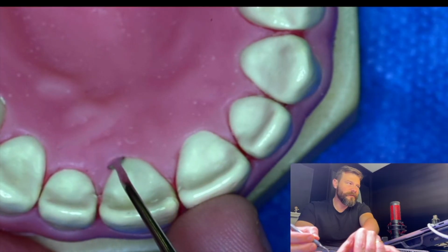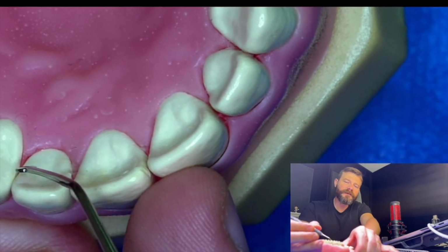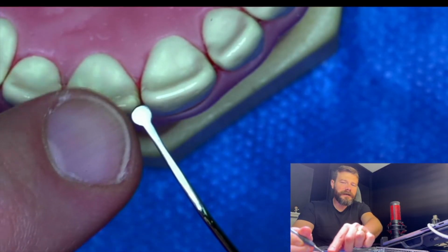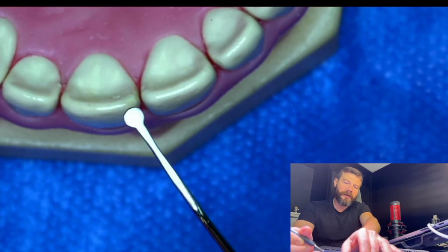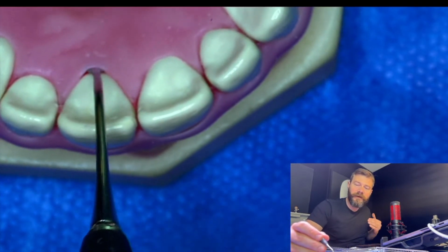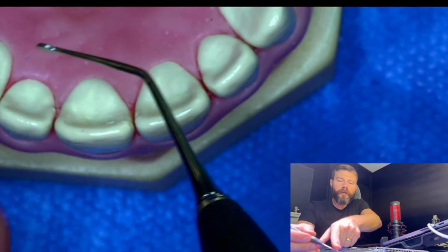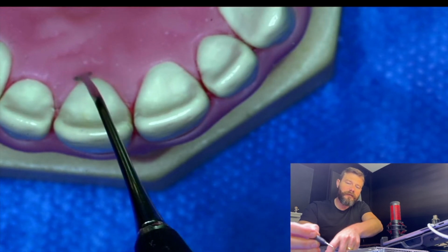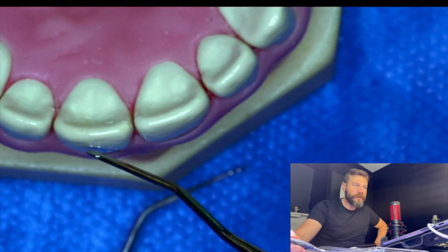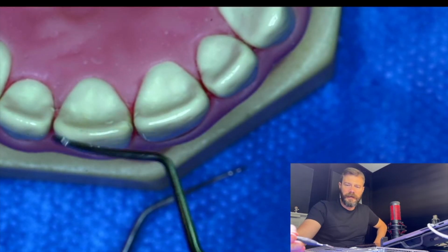Why is that? Because the curvature of the instrument makes it possible for me to achieve, on the lingual side, detaching the tissue. You see a more delicate design, more rounded, not so sharp, because on the lingual side I'm going to need to be a little bit more conservative when I detach the tissue. And to be honest, this single curvature is going to be much better for me to use the instruments on the lingual side compared to the regular curvature of the previous tunneling instrument that we discussed before.